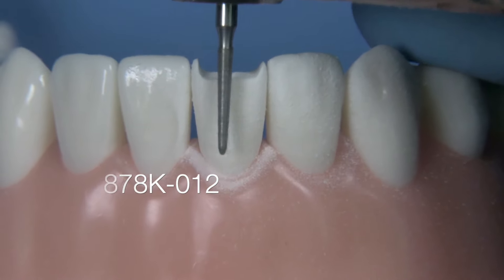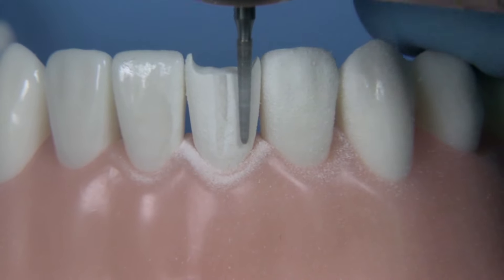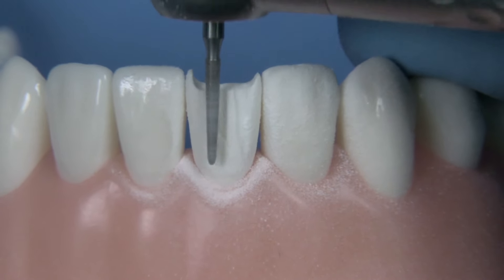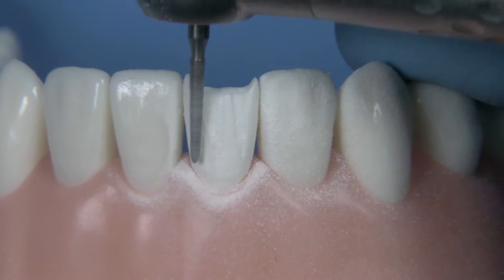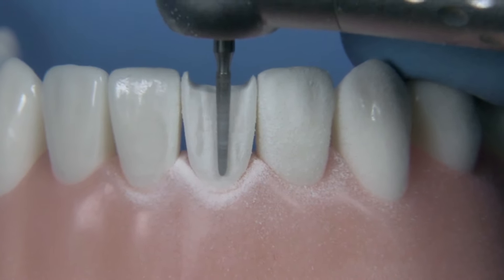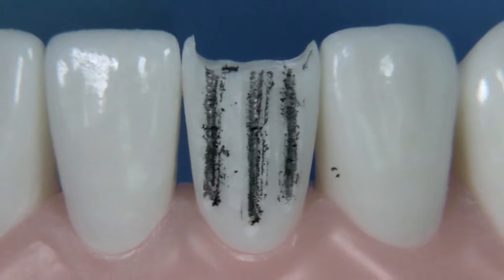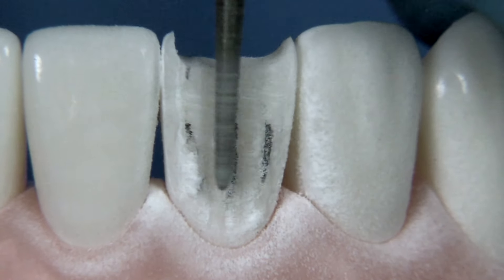For the facial we're going to be placing a few depth cuts utilizing the 878K012. This is a tapered diamond with a chamfer end to it and this will actually work quite well for creating the margin design and the finish line at the gingival as well. On these veneers you want to make sure that you only reduce the gingival about 0.3mm, the middle facial about 0.5mm, and the incisal facial about 0.7mm, so you can have a gradual increase in the facial reduction. It's nice to mark the depth cuts with a pencil so you can see where you've already reduced and avoid over-reducing those areas.